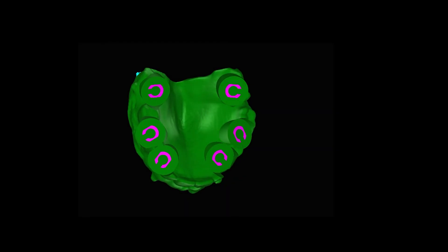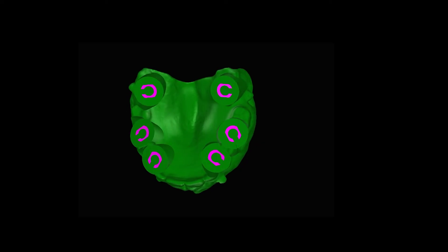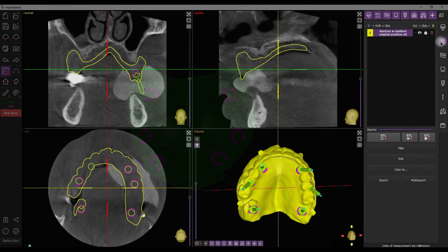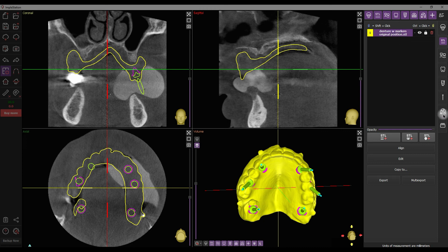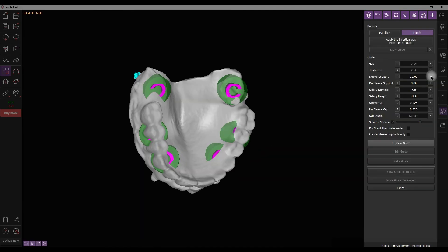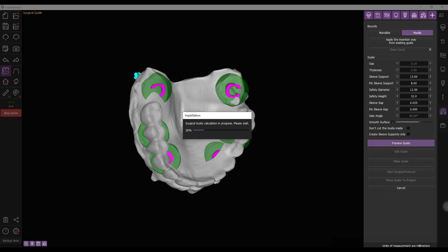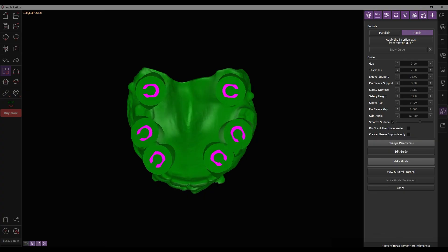Let's consider the creation of a guide based on the prosthesis. The process is similar. Choose the required surface, navigate to the Guide tab, and click the corresponding button. In the Generation menu, set only the guide parameters and follow the next creation steps without setting paths of insertion.